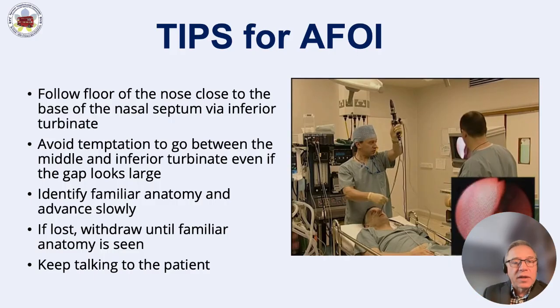You need to move in nice and slow. If you're lost, you need to withdraw until you recognize something and work from there. Mentally, I'm asking myself 3 questions. Where am I? I'm in the nasopharynx, I'm in the oropharynx, I'm in the larynx. What am I looking at? And what will I see next? If you can answer all these 3 questions, you're fine.